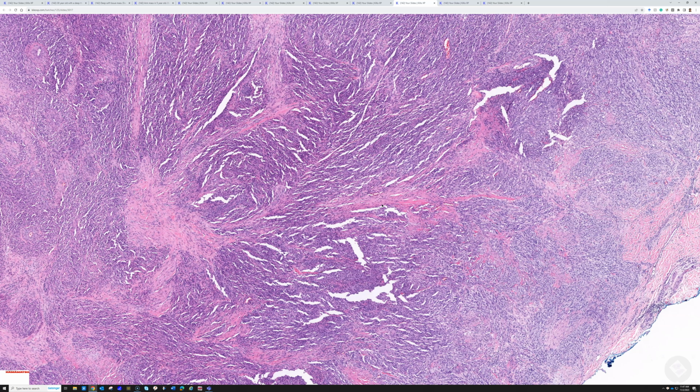And it's important to recognize that when we don't see the blood, sometimes our brain just skips right over thinking about vascular tumors. So one lesson that my mentor Mark Edgar taught me was that if you have a neoplasm that you're having difficulty classifying and you're having difficulty getting it to stain for anything, your usual panel is negative, don't forget to do a vascular marker. And I personally like ERG and CD31 as my two favorite vascular markers.